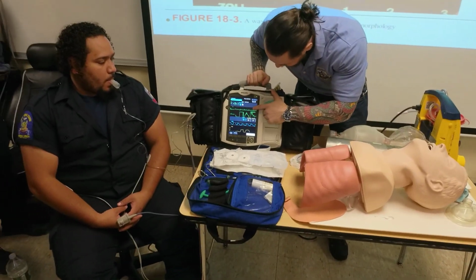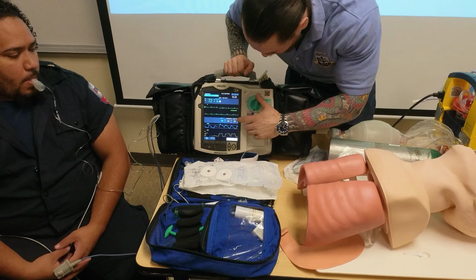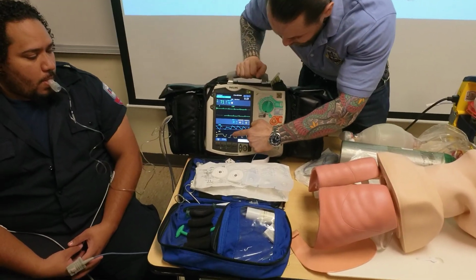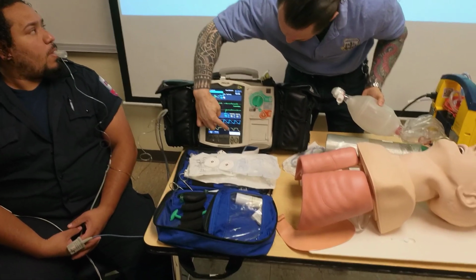At the top we see his EKG. At the bottom we see his pulse, and the pulse ox is 98. His end-tidal CO2 is 44. His respiratory rate is 18, and you see a good waveform. You see how these boxes are? This is real time. Every time I squeeze the bag, you have a rise, like this box is going.